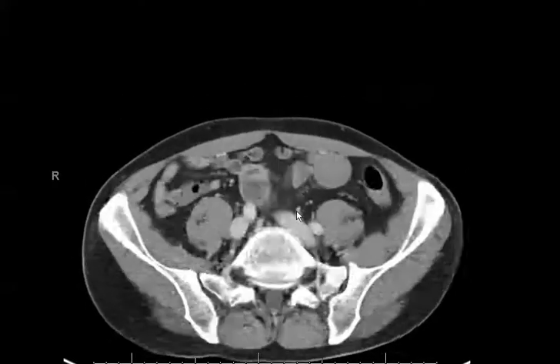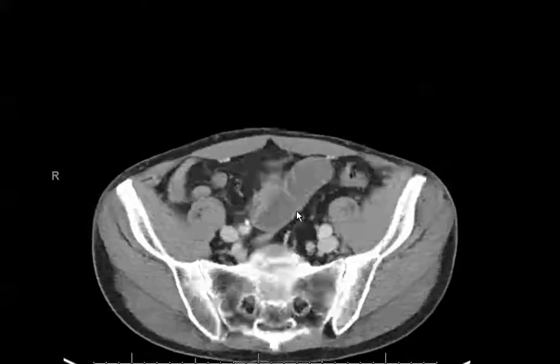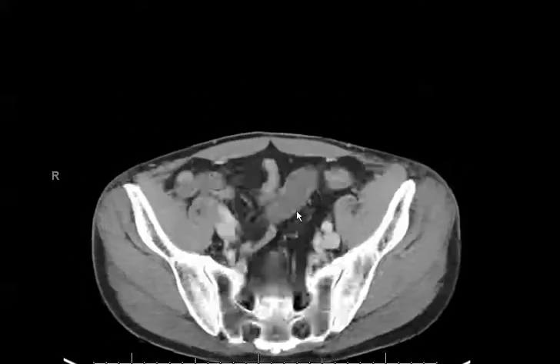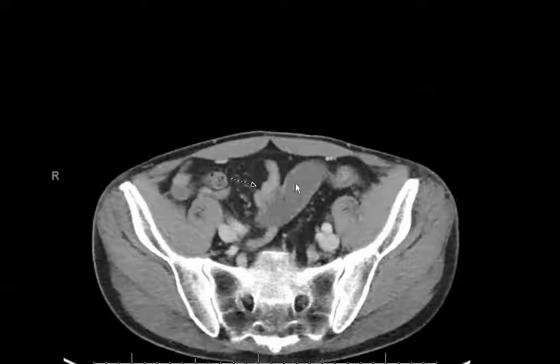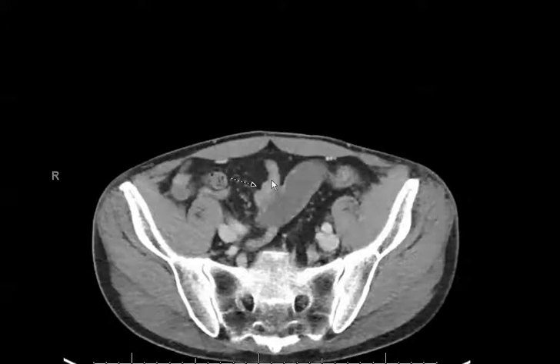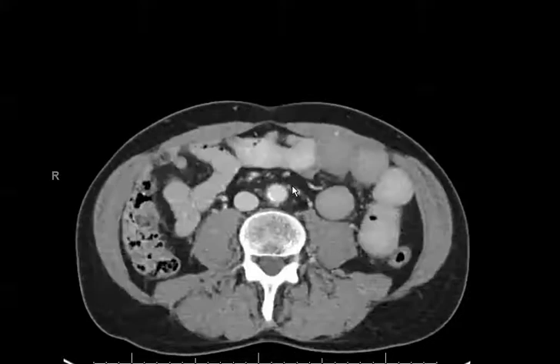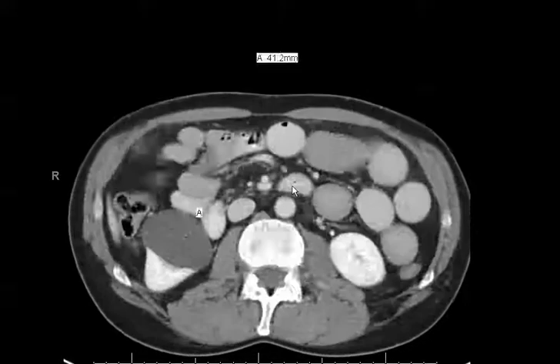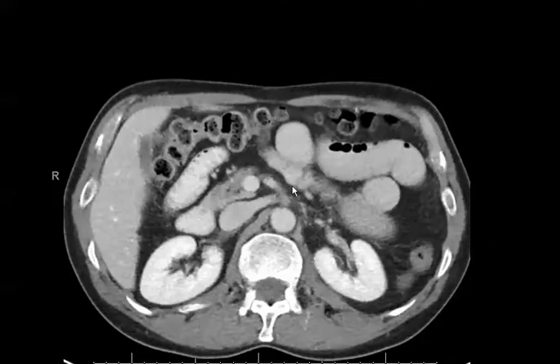As we scroll down more inferiorly to the level of the pelvis, we have a transition point where there is a dilated loop of small bowel and a decompressed loop of small bowel. These findings were consistent with a small bowel obstruction secondary to a midgut volvulus.